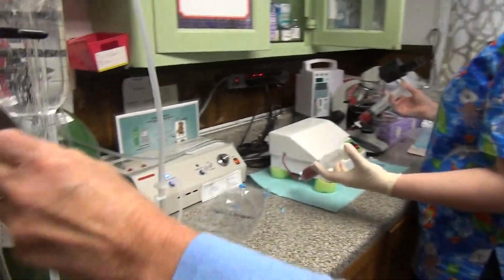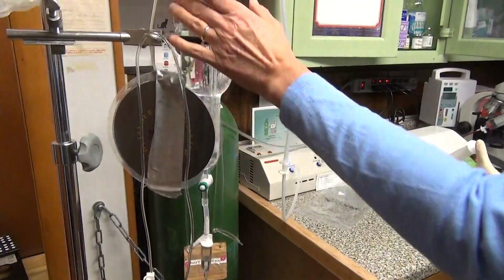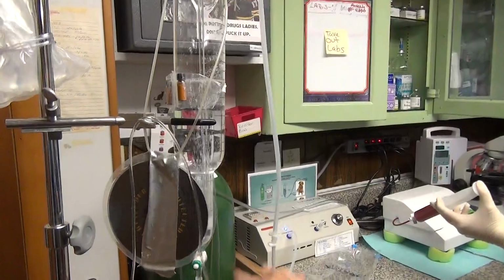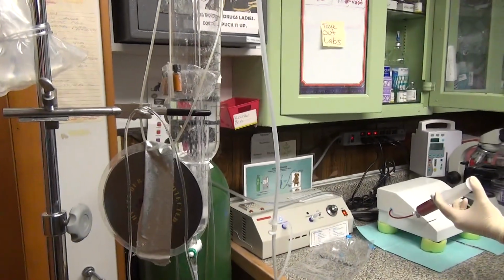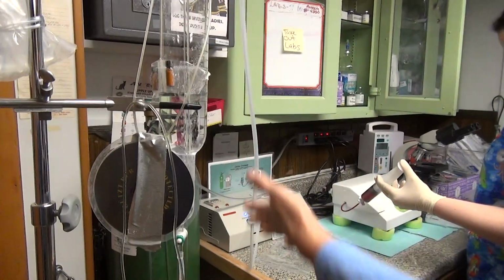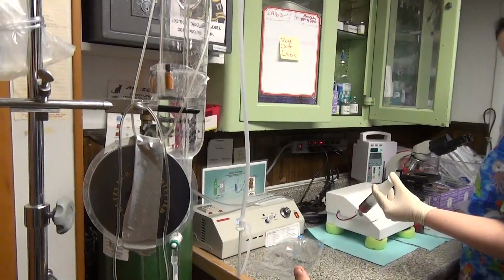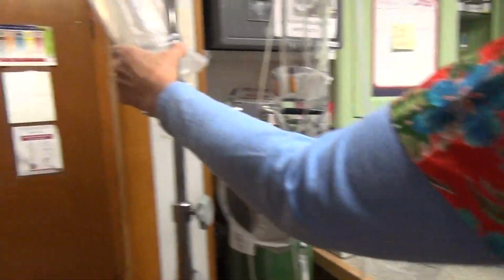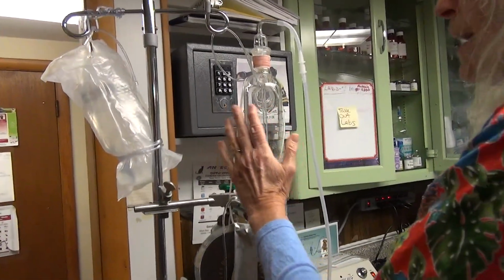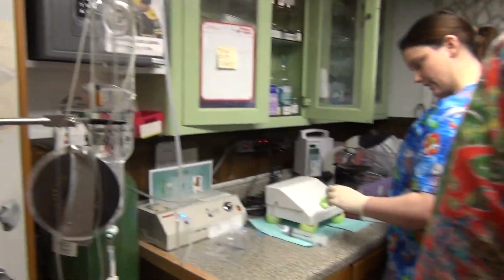I like these tachyon pieces to be here. What it's supposed to be doing is breaking up water molecules, and that energy goes through, and so it's just something I started doing. Having the ozone close to this unit and being able to transfer to the next one is something we've started doing because we use so much of it. As you can see, we counterbalance with a bag of saline, because if you just have this on an IV pole and somebody tips it, it can rock back and forth and this can fall.